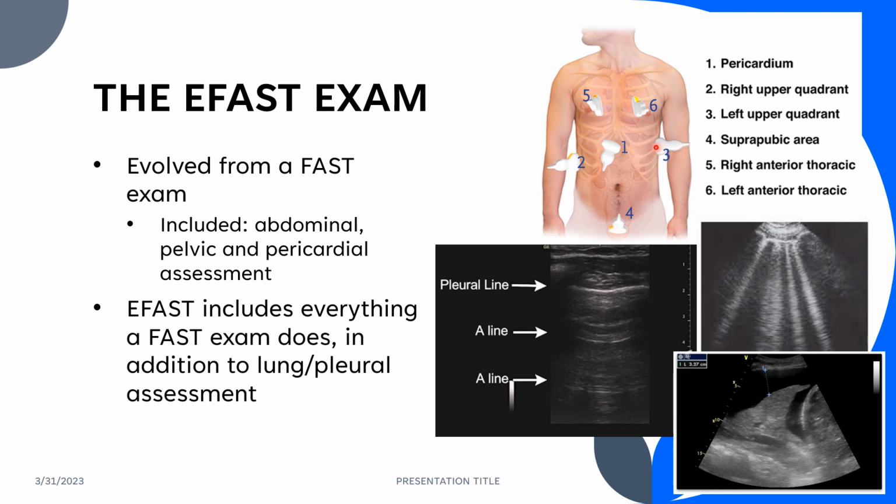Then you would slide down a little bit, and you're going to be evaluating the spleen here. Be aware that the spleen can be slightly more difficult to evaluate than the liver because of its location and its size. So make sure that you're looking in the subdiaphragmatic or subphrenic area, evaluating for any ruptures between the spleen and the diaphragm. And then you'd want to continue inferiorly here, and you're going to evaluate the spleen's interface with the kidney.